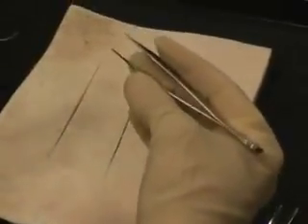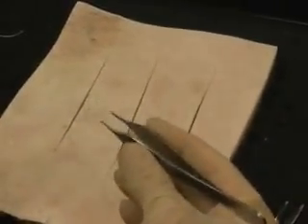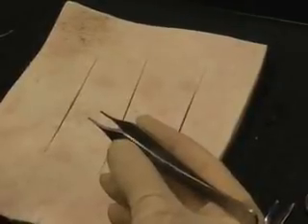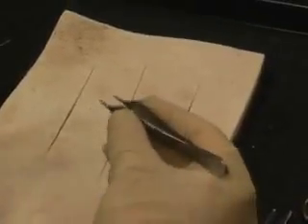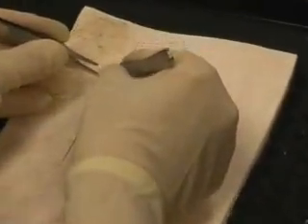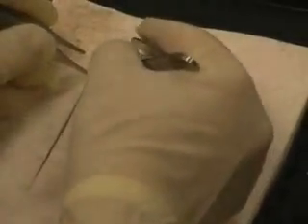Oftentimes in the OR setting, there's an everter, and the person who's an everter is going to have 2 forceps. Oftentimes the surgeon likes to be the everter, and the first assistant gets to control the staple gun. The pig is very difficult to evert, but essentially I'm going to start far away and come toward myself here.